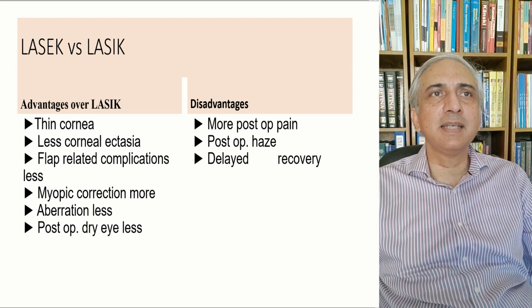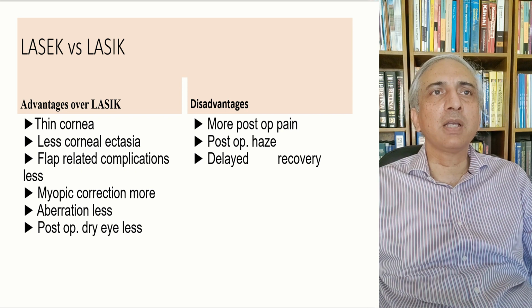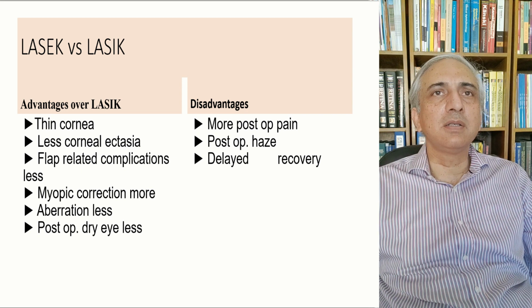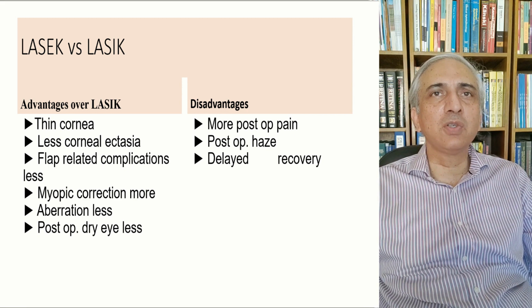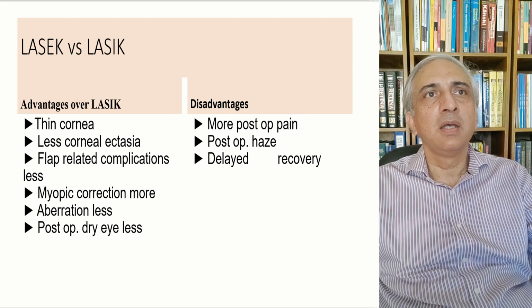Advantages of LASEK are a thin cornea is suitable, less corneal ectasia, no flap-related complications, and it allows more myopic correction, less aberration, and less postoperative dry eye. Disadvantages of LASEK are more post-op pain compared to LASIK, more post-op haze, and delayed recovery. This is actually the post-op haze because of which people stopped using it.